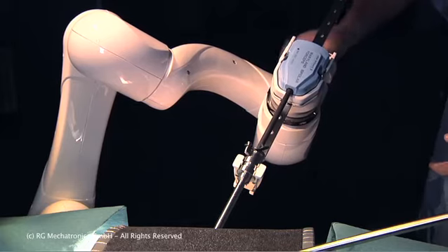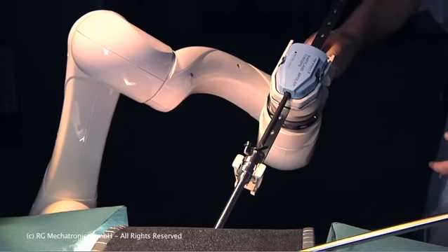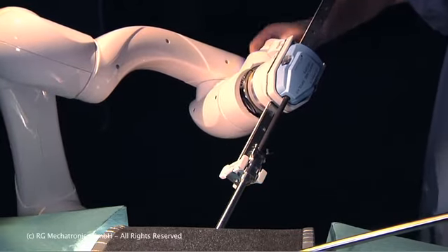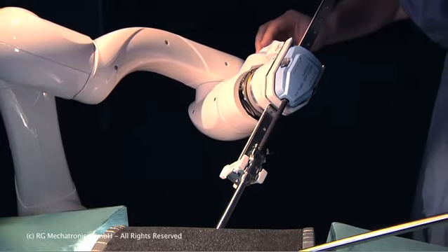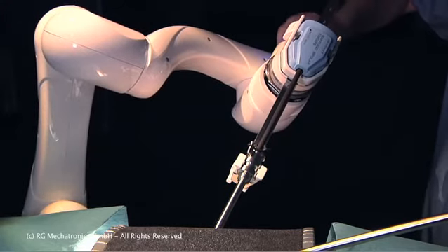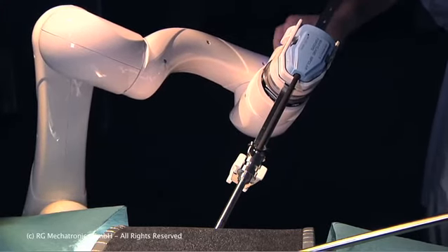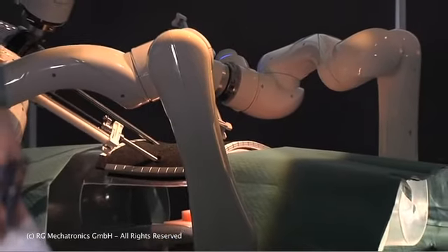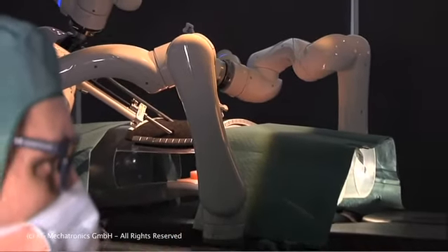Now the trocar roll is changed, which allows a repositioning of the robot, and then fixed again, and the fine adjustment performed. Once all the robots have been docked, the operation can start.